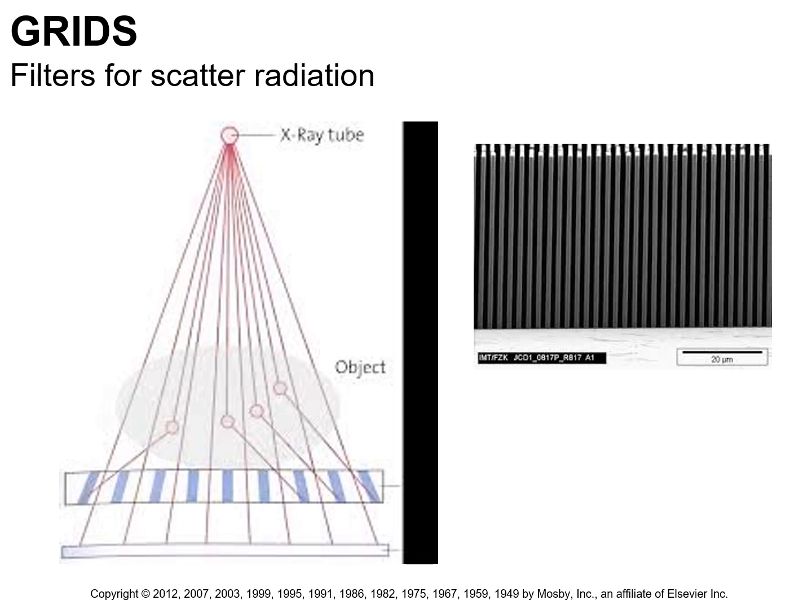And so the only way those slots of lead actually absorb any of the X-rays is if the X-rays change direction, okay? And so that's what we call a focused grid. The grid is geometrically aligned with the path of the primary beam. So as long as those photons don't change direction, the grid will really ignore those. It's the photons that scatter and do change direction that end up being absorbed by the lead strips, okay? And it's just matching the geometry of the expanding beam, and that's how we get that done, okay?